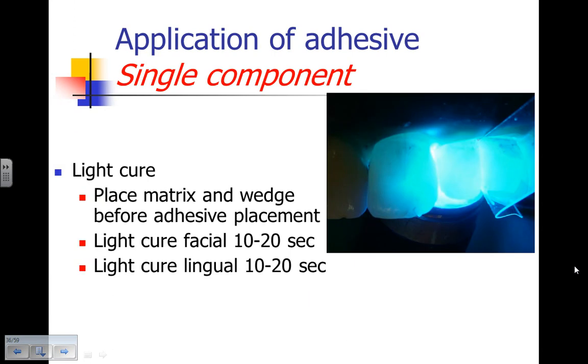Here we see the light on the lingual surface, light curing the adhesive with the presence of a mylar strip so we don't join the two adjacent teeth together. We light cure the facial for 10 seconds. We light cure the lingual for 10 seconds. The amount of time we light cure is based upon how close we are to the surface. The light is at right angles to the preparation. The light is as close to the tooth as possible.